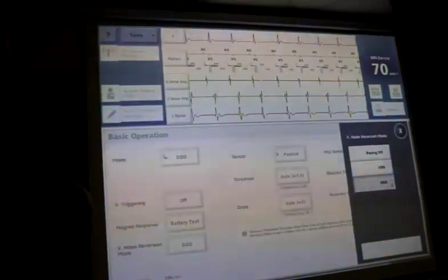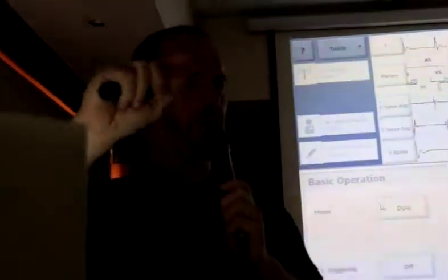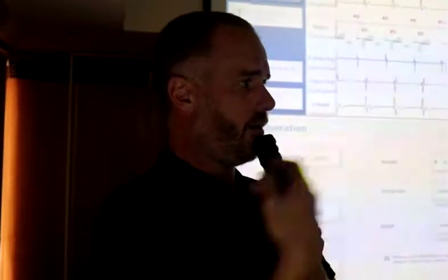So for instance, if my electrical system in my house is not very good, and I'm touching the taps, and current is going in my arm, and coming up here and coming out this arm, that could inhibit the pacemaker, okay? You're not going to be electrocuted, it's very low current. But it could inhibit the pacemaker.